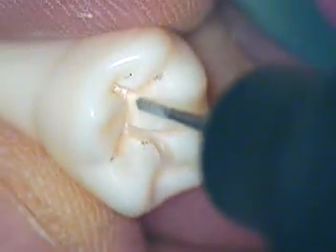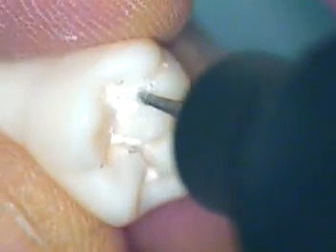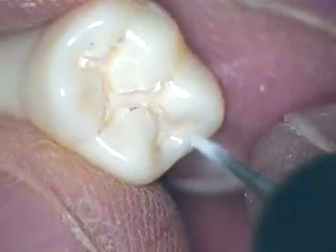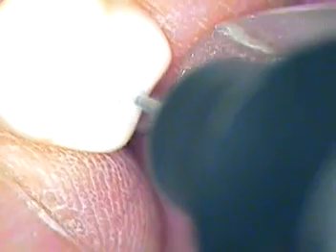I'm going to hold this button as I just snug it — not too tight. Turn my motor on to number 4 again. Come right back in. This is where you really want to lock your wrist and your fingers so you don't deviate. Go in, you'll feel the base start to cut. Just go straight in, parallel with the long axis. The focus is just getting everything uniform and smooth.